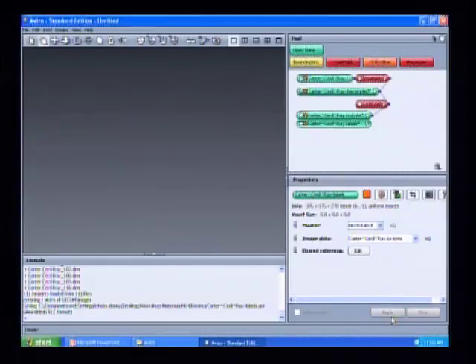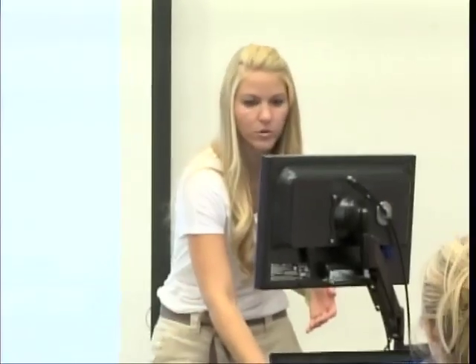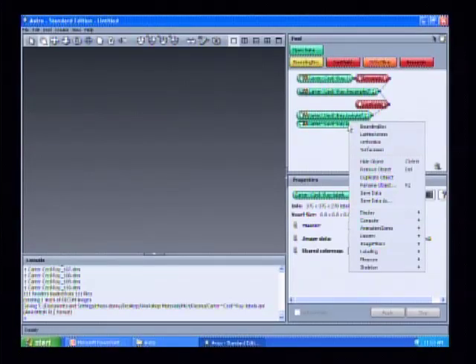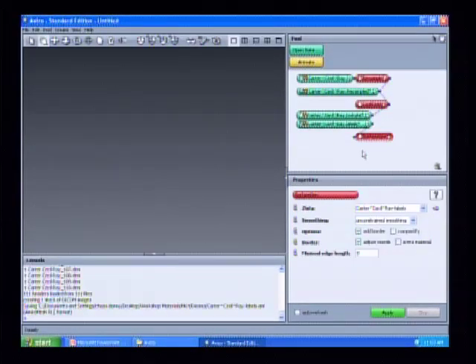So now we're back to closing that out anyway. What we're going to do is create the 3-dimensional model. In order to do that, you want to right-click on your labels file, and go down and select Surface Gen, so that this is going to generate your surface.